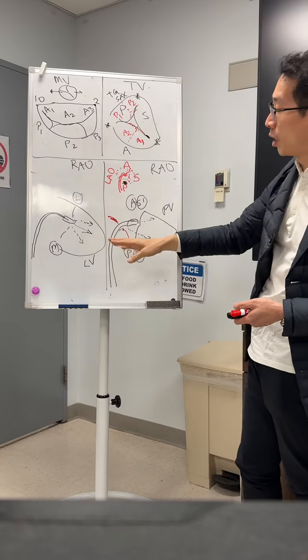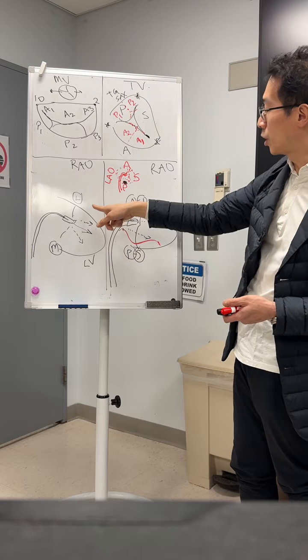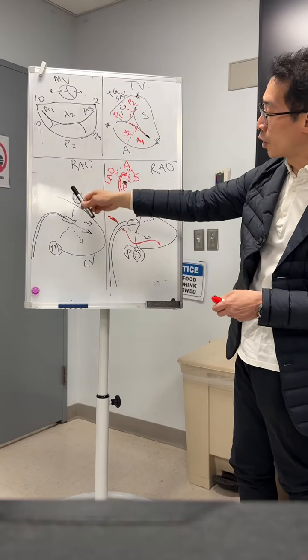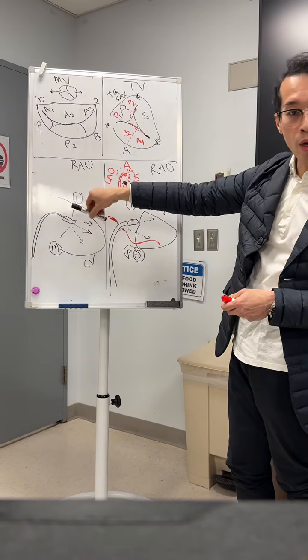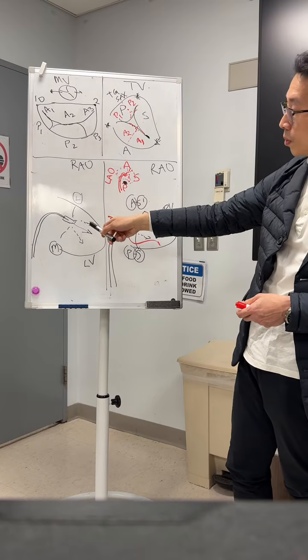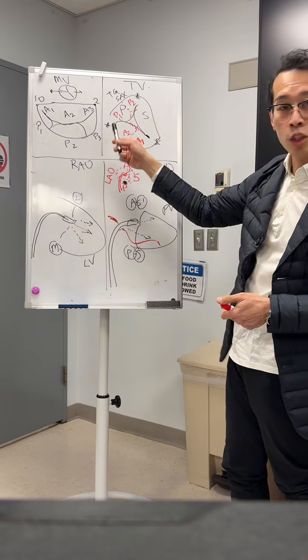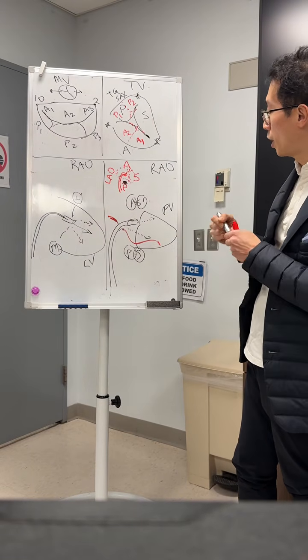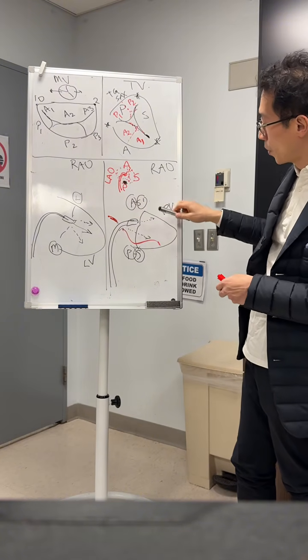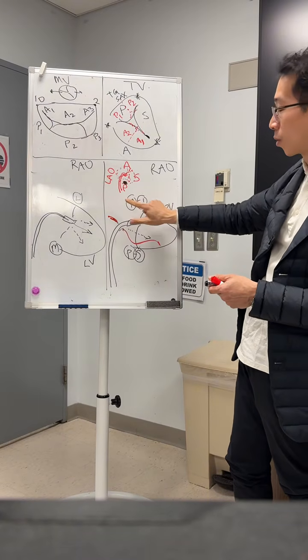And then fluoroscopically, in terms of where you are, on the mitral side with LV, this is going to be the lateral, medial, and then you have to make sure that you're not having a trajectory bias. You want to be perpendicular, and then you want to take the parallax off the clip or the device, the clasp device, once your orientation has been optimized. Same thing for tricuspid. So you can see here that AS will be this way, PS will be this way. We rarely do AP. AP will be in the middle, which is definitely not correct.